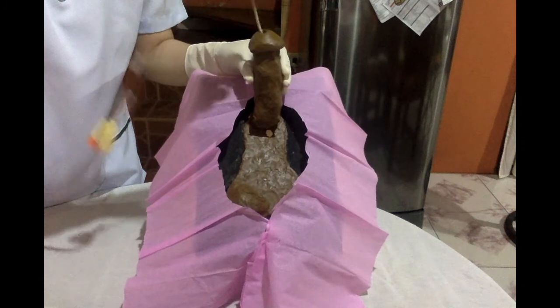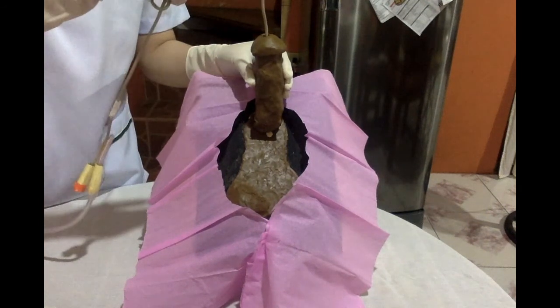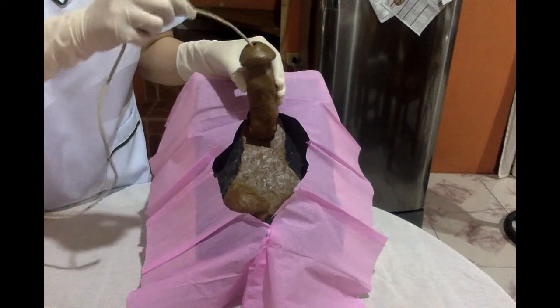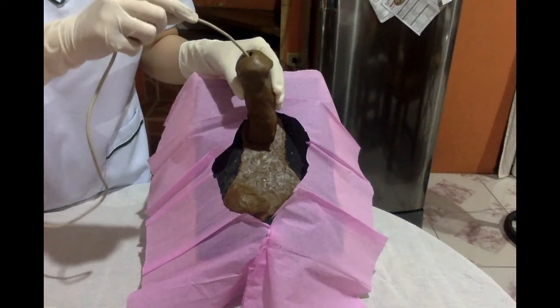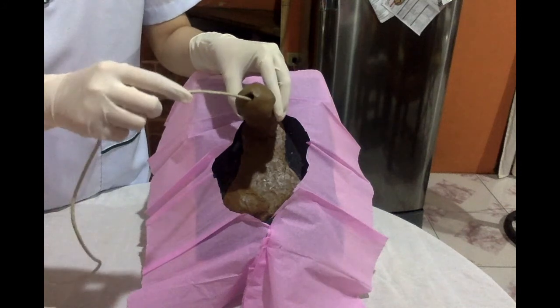Then I will now insert the tip of the catheter slowly through the urethral opening 7 to 9 inches. So assuming that the urine has already returned, I will now lower the penis to about a 45-degree angle, especially if there is no resistance met.